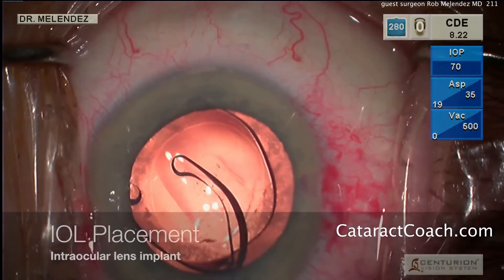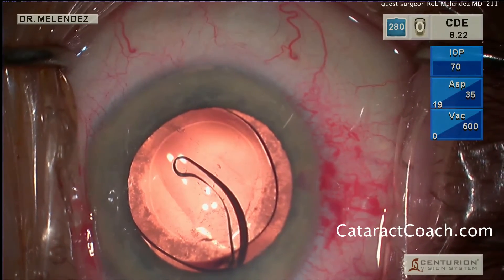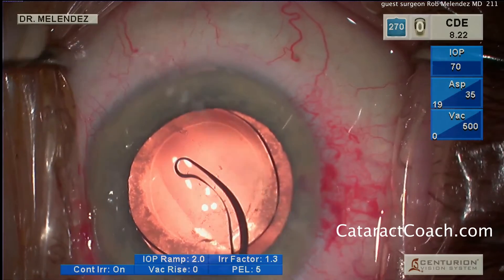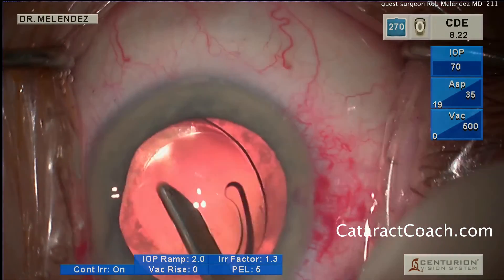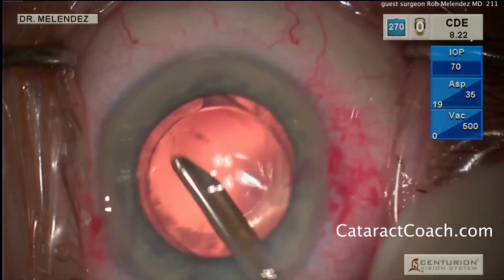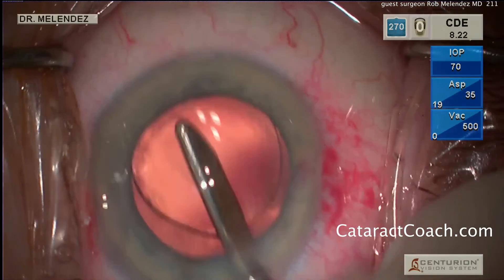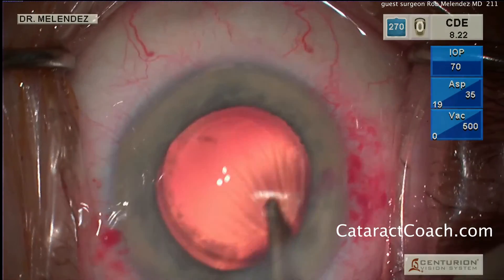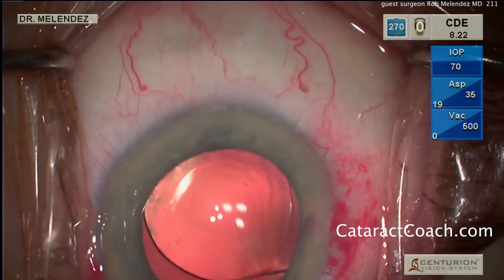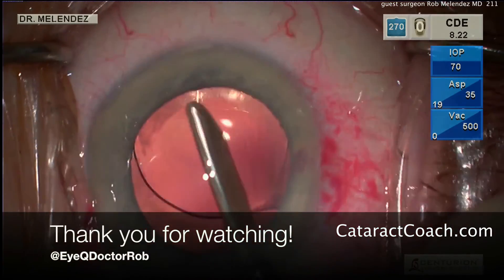And then finally, removal of the viscoelastic. I always find it fascinating to learn from other surgeons. I didn't realize, though I've been friends with Dr. Melendez for many years, that he used the Simcoe to do his procedure — that's something a little different, and something that works really well in his hands. He's even going behind the IOL here to remove the viscoelastic.